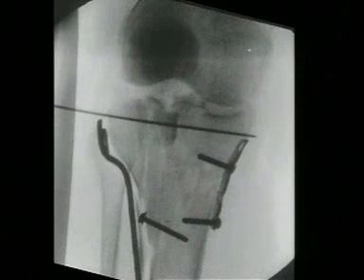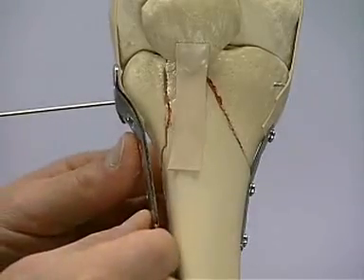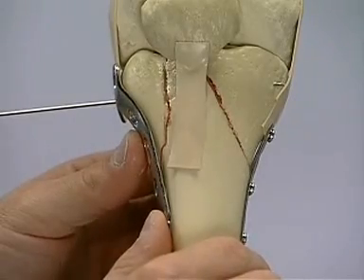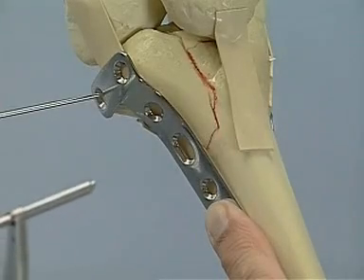Before placing any screws, it is advisable to check the quality of the reduction by x-rays in two planes. The articular surface can also be visualized. The correct position of the K-wire allows the plate to be slid over. The first hole should be drilled through the slotted hole, thus permitting some secondary correction of the plate position. In our model, this will be an interfragmentary lag screw.